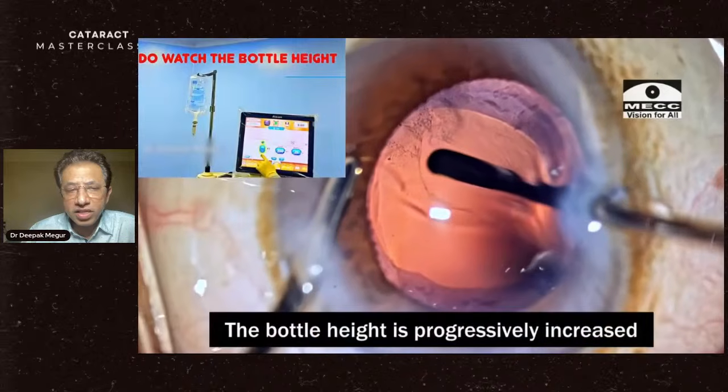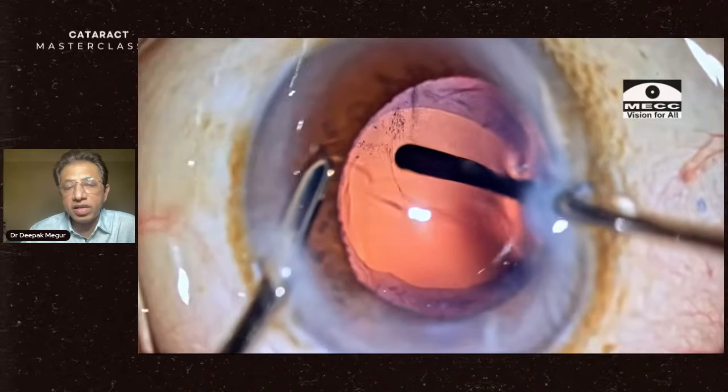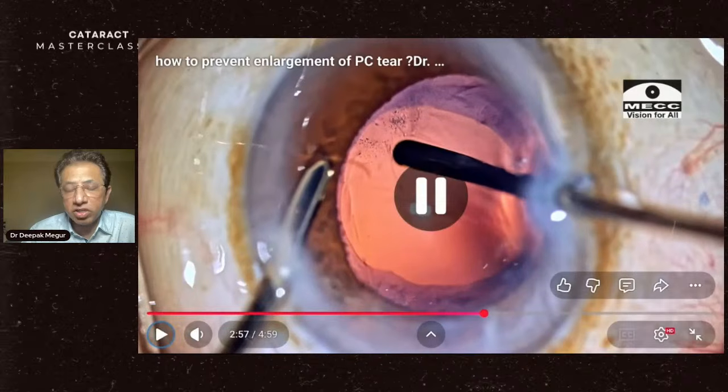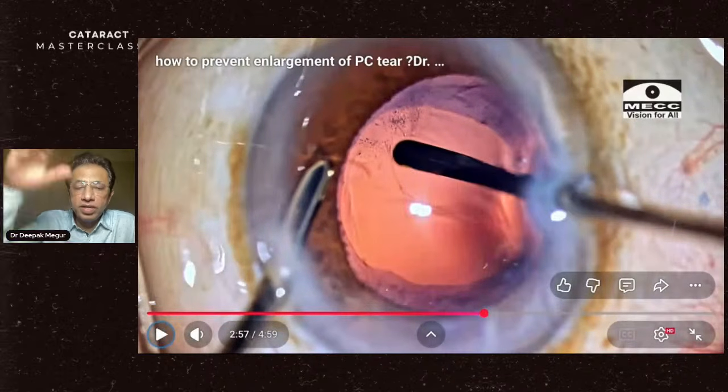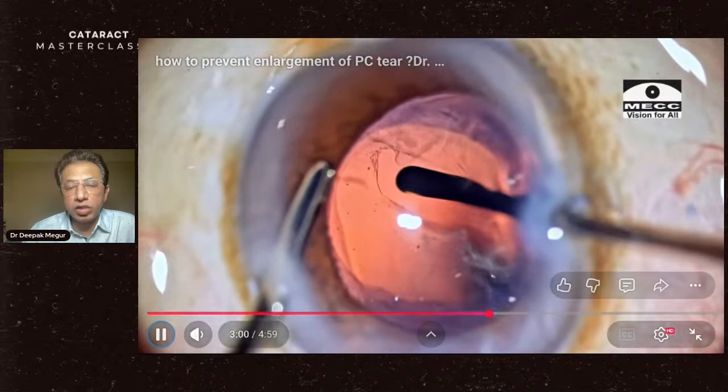So at all these stages, the bottle height was kept low. But now when the vitreous is cleared off, the chamber starts to flutter. That's the time when you want to increase the bottle height. So that's probably indicative of the end point as well.